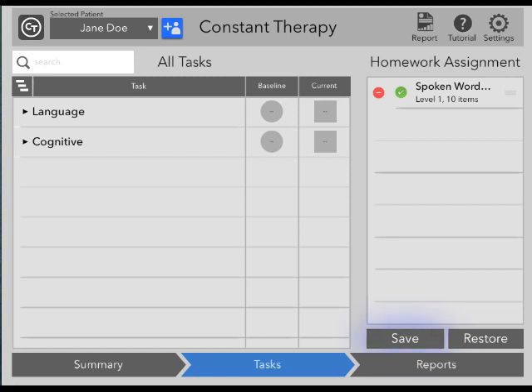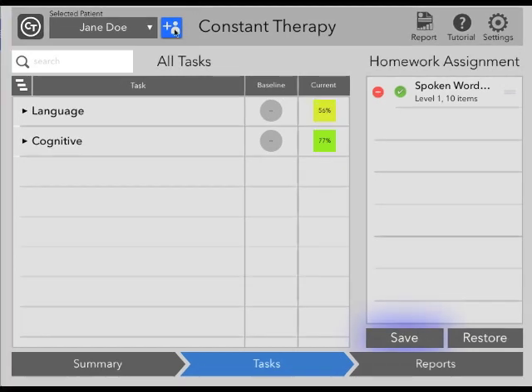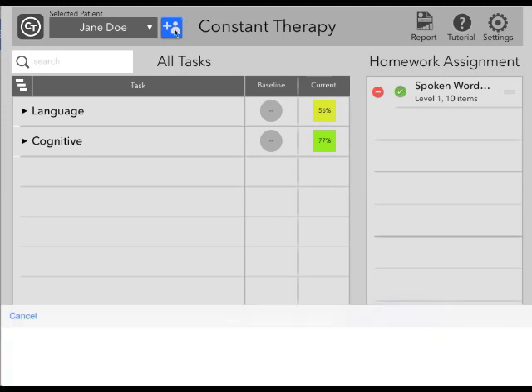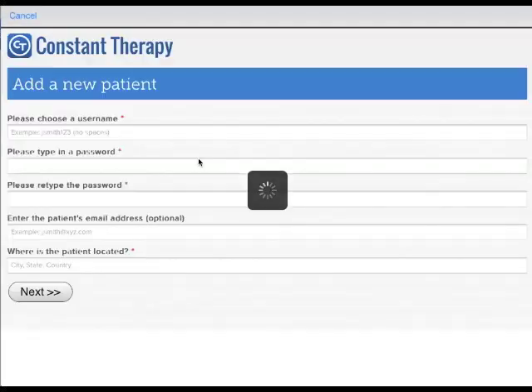Before we get into the details of the Tasks tab, let's review some basic options that are always available to you at the top of the screen. When you are logged into Constant Therapy, several key tools will always appear at the top of the page. You can add a patient by tapping the blue icon and adding your patient's information.